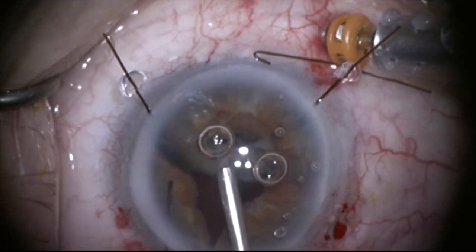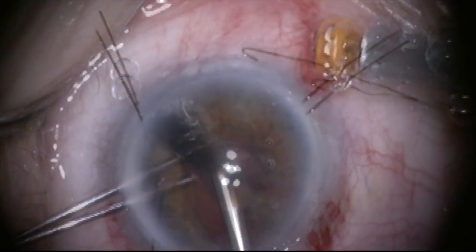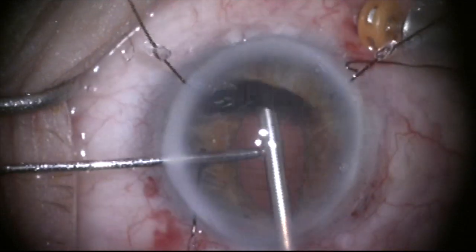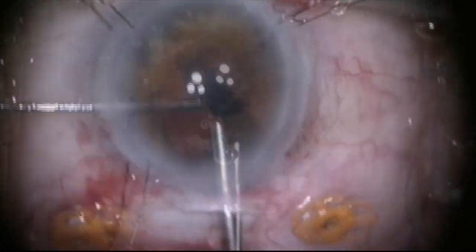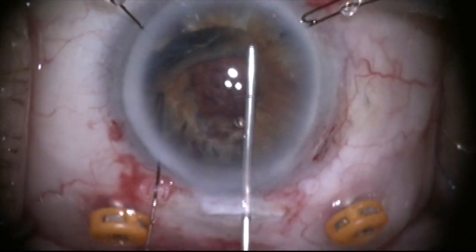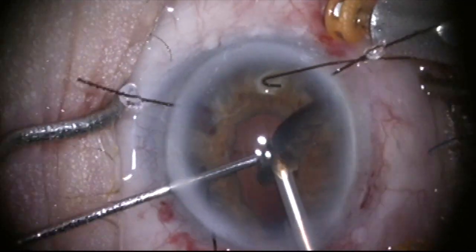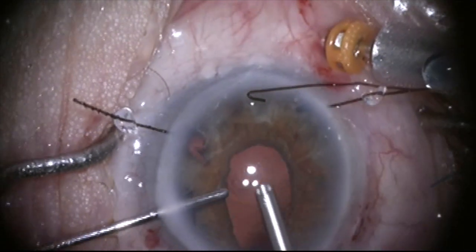I put the fragmentome in through the main incision, fill the anterior chamber with dispersive viscoelastic, and — I've sped this up a bit — this is a really dense piece of lens material that took a lot of energy and a lot of time to eliminate. You can see how black it is, which is very unusual for a Soemmering's ring fragment. I add more viscoelastic to deepen the chamber, protect the cornea, and trap the piece, and with the fragmentome I successfully eliminate all of the lens material.